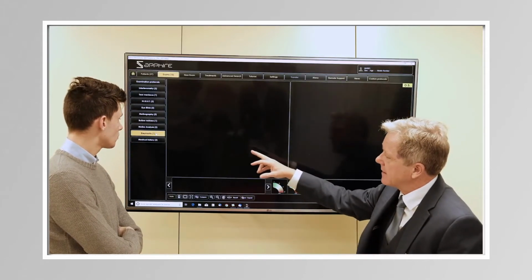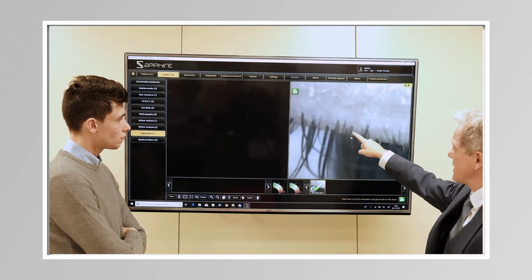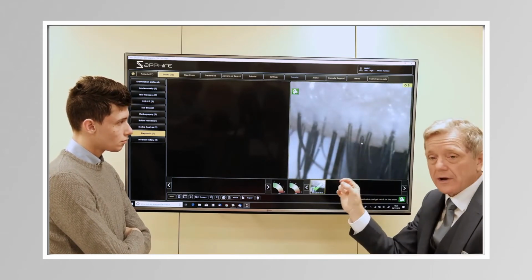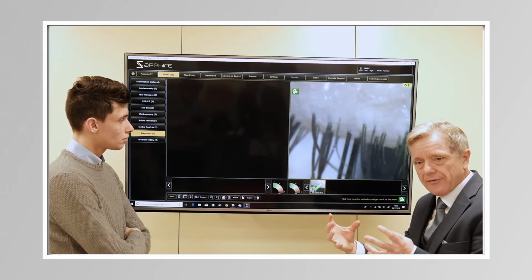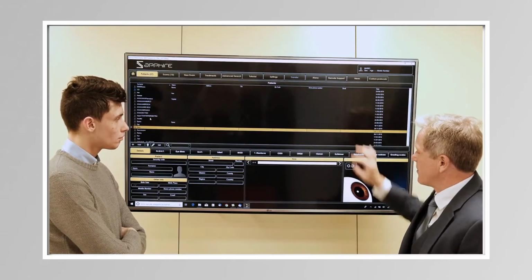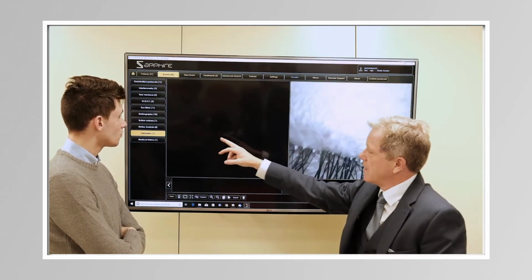Let's go back and look at the blepharitis. We actually imaged the base of the lash here. We can see in Mario's case the lash itself and the base of the lash is pretty clear and clean. So he doesn't have blepharitis. If there was blepharitis, we would see a little collarette or little squamous cells here at the base of the lash. Let's go back to the examinations.